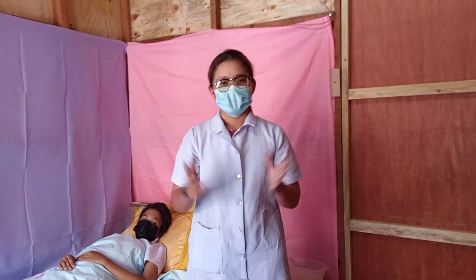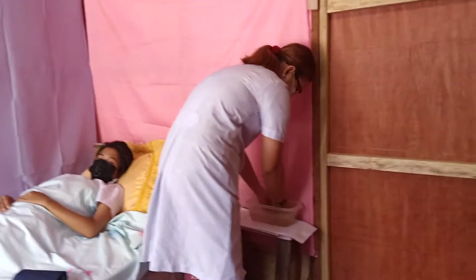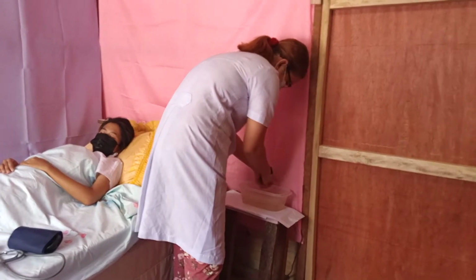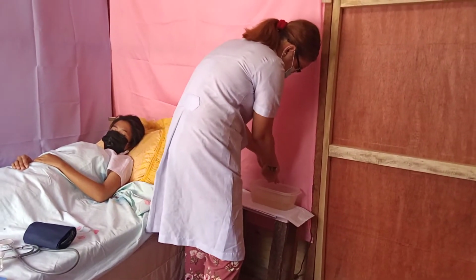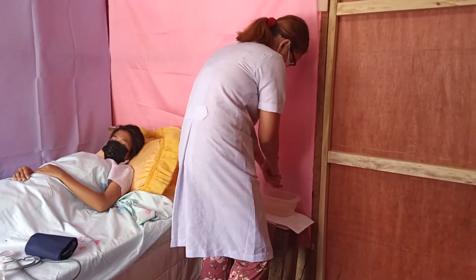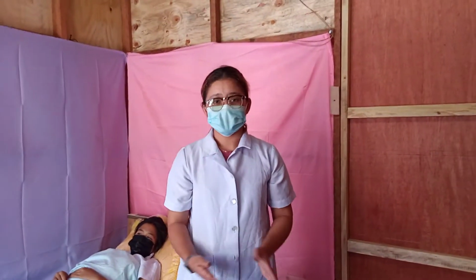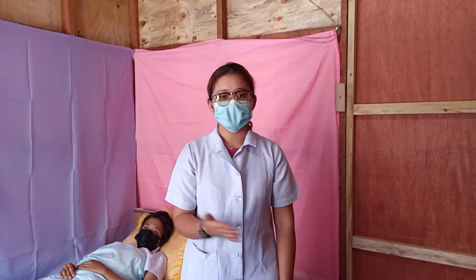Next procedure, wash hands to decrease the transfer of microorganisms. Then, after we wash our hands, the next procedure is place client in a comfortable position, lying or sitting.